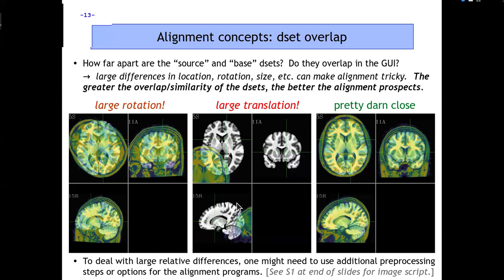We can start with a center of mass step to try to do something quick to align these better. Rotation can be quite hard because we don't know the rotational difference to start. And we're worried that with a different fit, we might get stuck in a local minimum of poor fits, where instead of unrotating the brain, it would just get geometrically squashed in one way, and the algorithm thinks it's doing a good job, but it was never close.